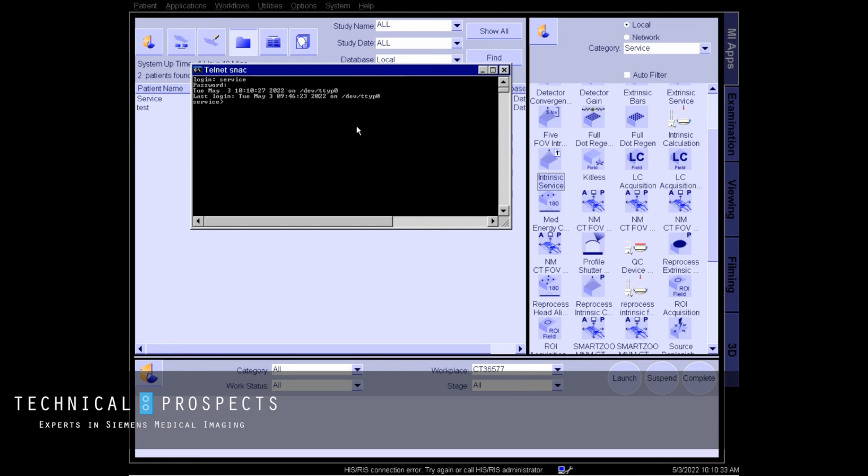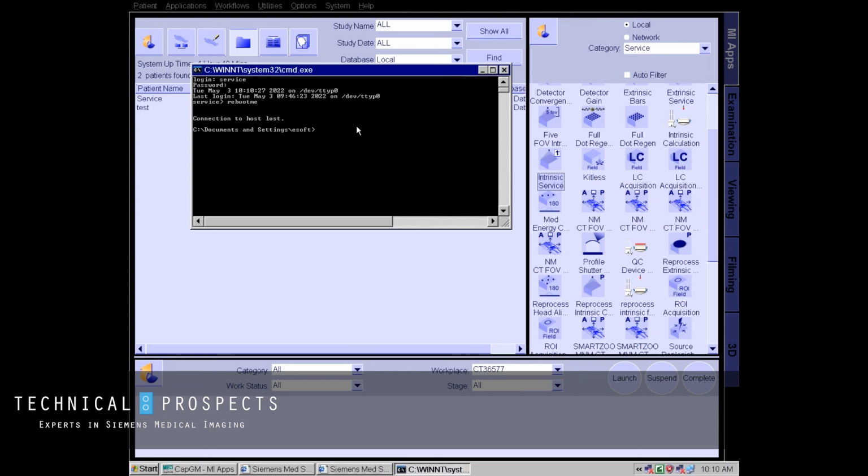To reboot the SNAC remotely, I simply say reboot me, and I press return. The connection is lost, but also the SNAC is rebooting.